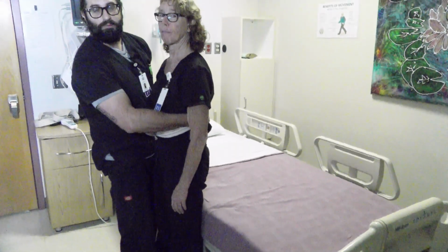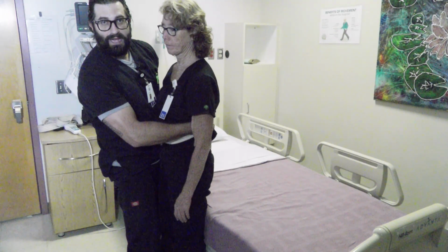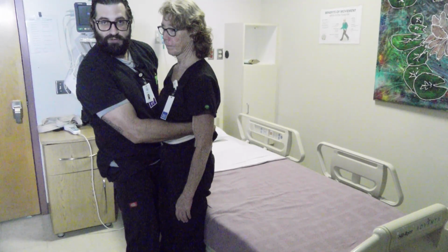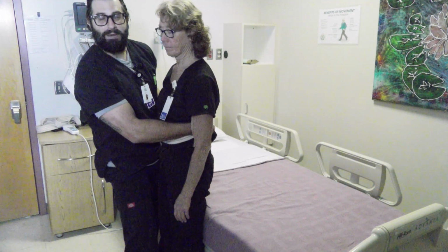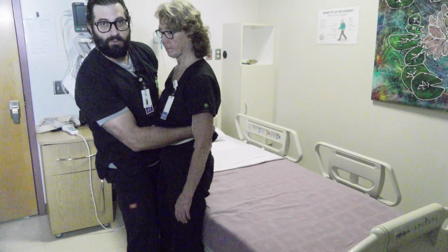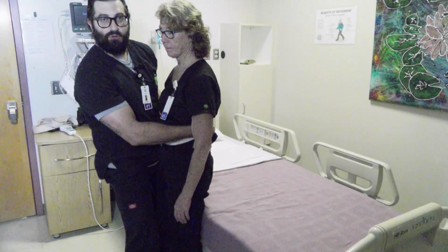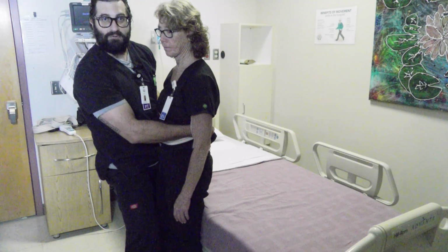What I've done is I've helped this individual stand up. I'm close to them. I'm supporting their body weight. Their body is very close to the middle part of my body, my belly button and my spine, so that I'm protecting myself. And I've got a good grasp around their low back pelvis area. And then you can either do the things that you need to do or have the individual sit back down.